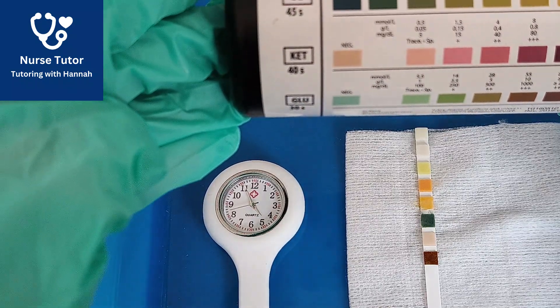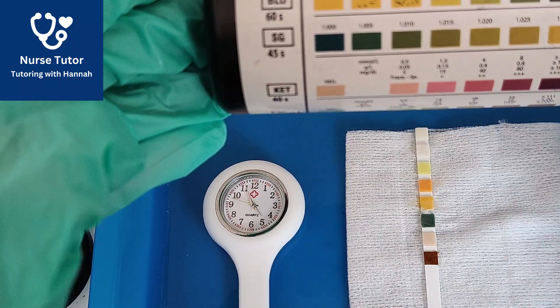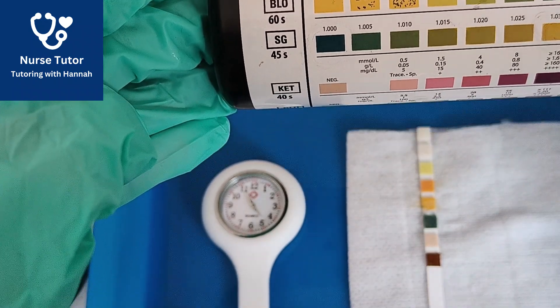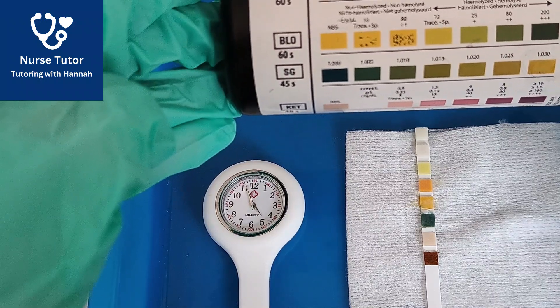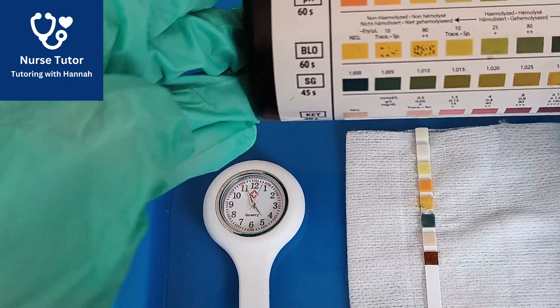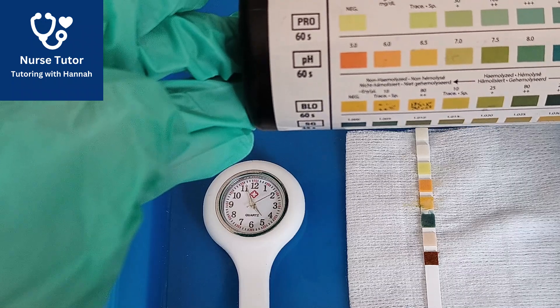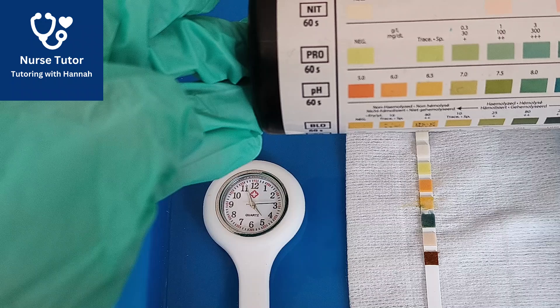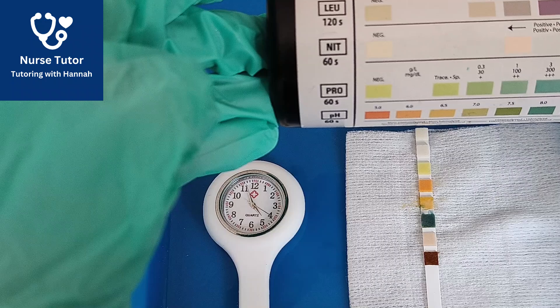40 seconds has passed — my ketones is negative, still that pink square. At 45 seconds, with the hand reaching the 9, I read my specific gravity — dark green there, which is 1.000, so quite dilute urine. Now waiting 60 seconds for the hand to get all the way around to 12. 60 seconds has passed — I'm reading my blood, which is negative orange. My pH is a darker orange, which is 5. The next one is my protein, which is negative — still that light green. And I can read my nitrite as well — it's white, so that is negative.